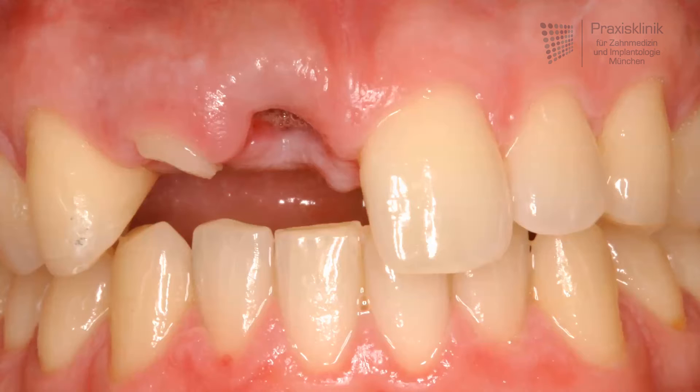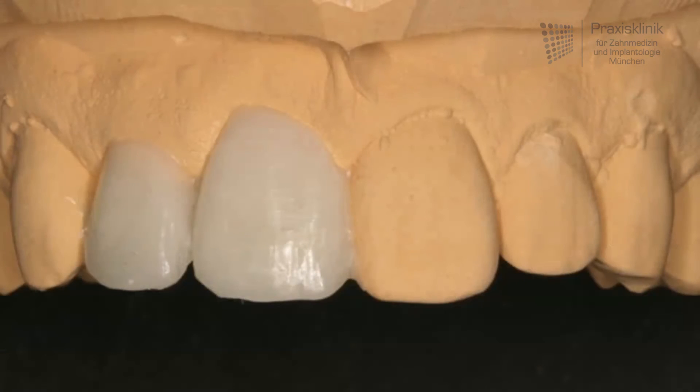The next step is done in the dental lab. To have an idea about the intended implant position, the dental technician makes a wax-up and shows us how the desired treatment outcome will look like.